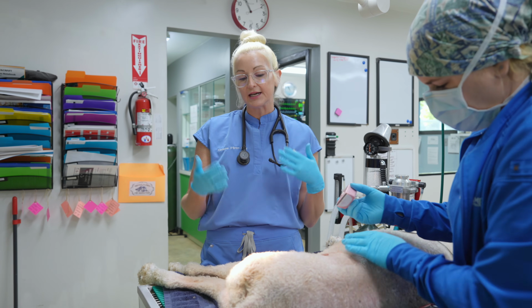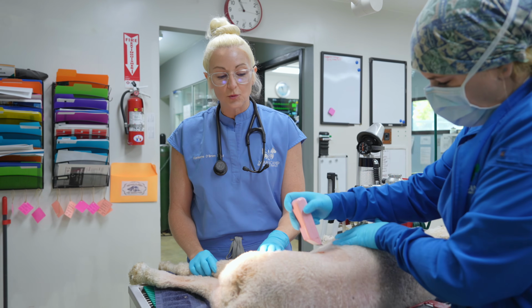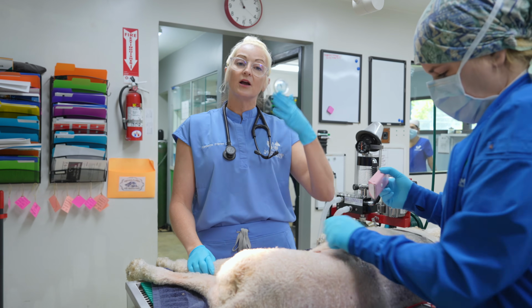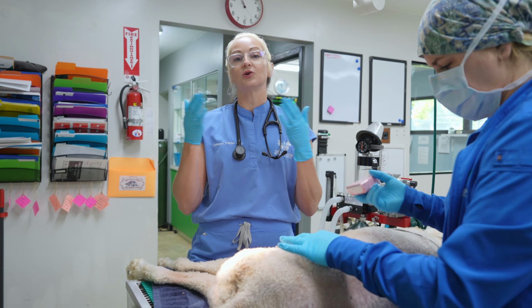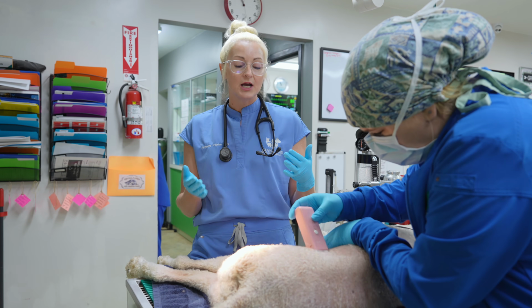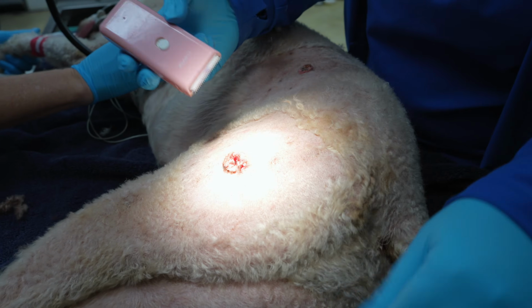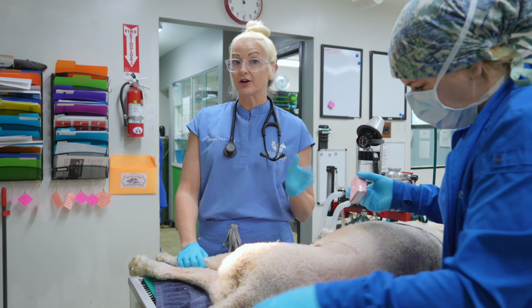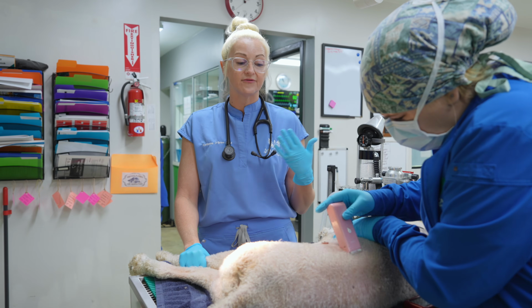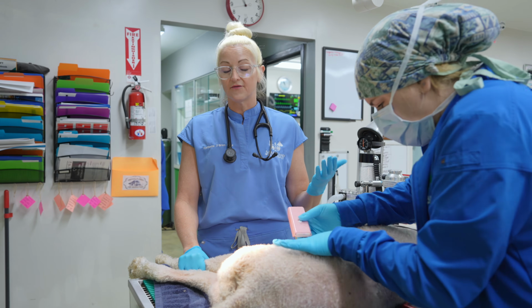Those are skin glands that got bigger and then came to the surface of the skin. Sometimes we'll keep them on the body if they're smaller and we've already identified, like let's say we took off a tumor, we sent it to the lab, they told us it was non-cancerous, and then we had another lesion that popped up that looked exactly the same. Sometimes they'll be pink, sometimes they'll be white. They can look kind of cauliflower-ish. These are a little bit larger than our typical sebaceous adenomas, therefore we are going to send them to the lab and identify if they are or are not, and if we should be removing the rest of them.